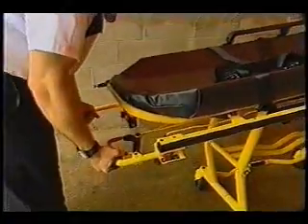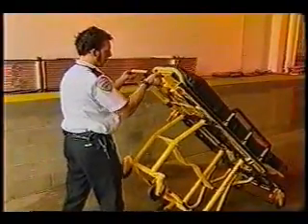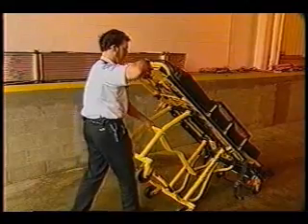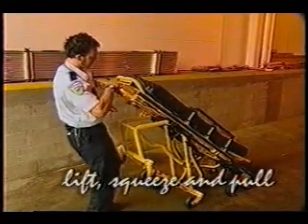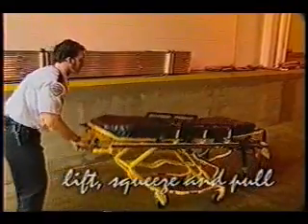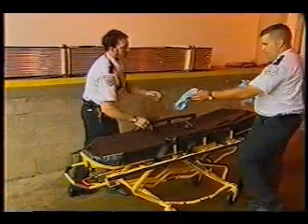A single person can lower an unoccupied cot by first tipping it onto its load wheels. If you're in the highest position, release the auxiliary lock. Brace the base of the cot, grab the center base tube. Lift the litter frame slightly and squeeze the height adjustment release handle all the way to the grip. Releasing the height adjustment handle will lock it into position.